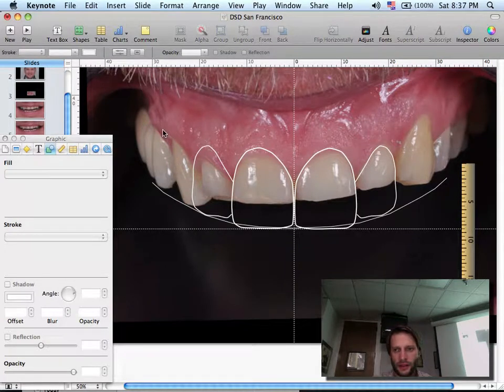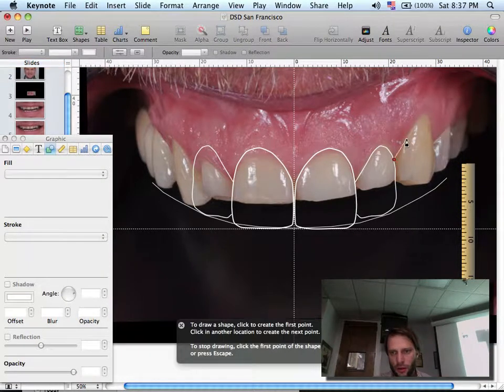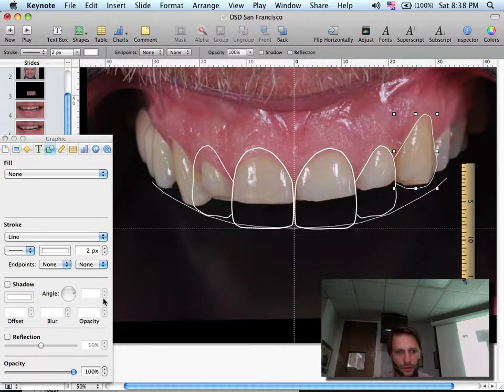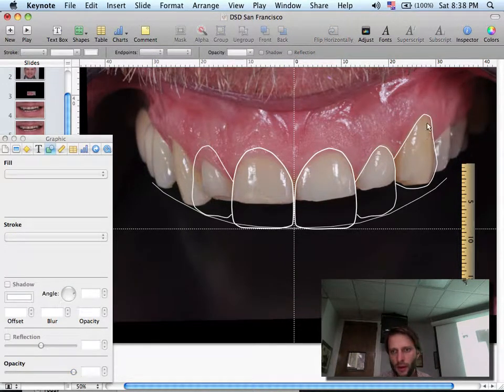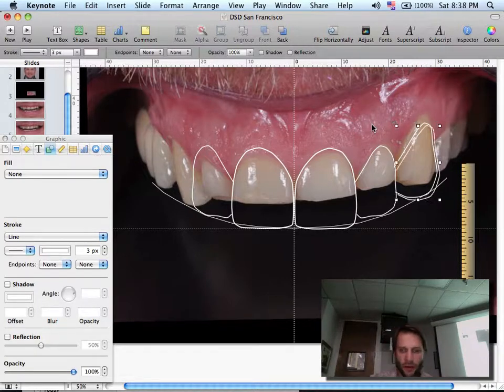And then the last information here is the cuspid. So I will draw this one. Now, if he doesn't show the cervical of the centrals, you can imagine the cuspid. So this really doesn't make sense to bother here, but what I want to do is to bring this down and say, okay, if I increase the length, this is a nice proportion. Now if I flip to the other side, let's see what happens.